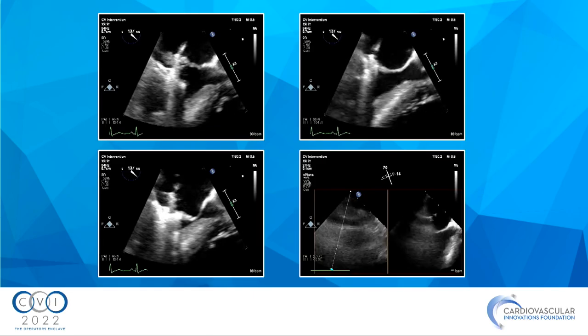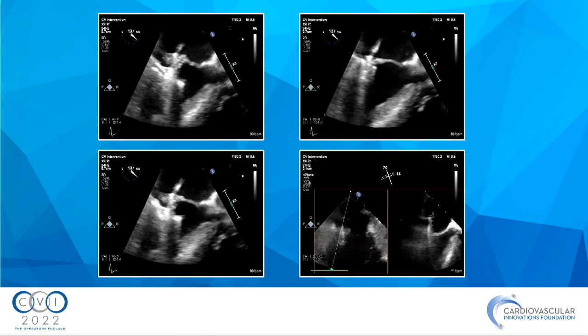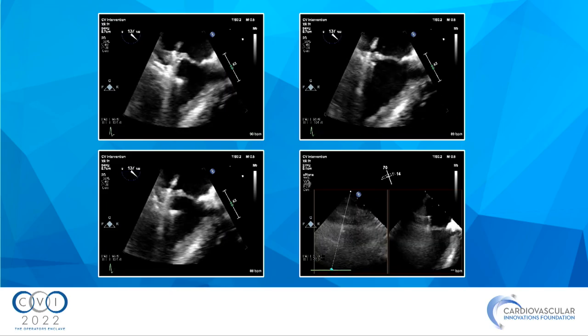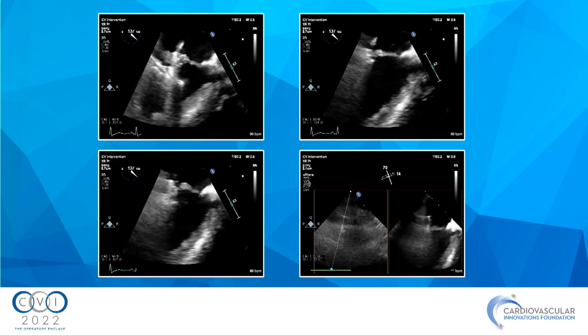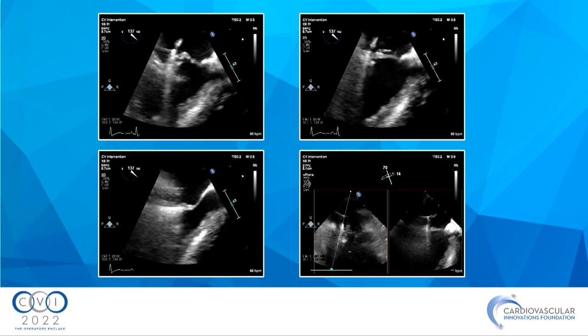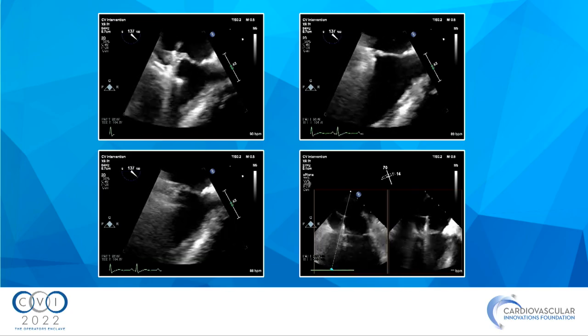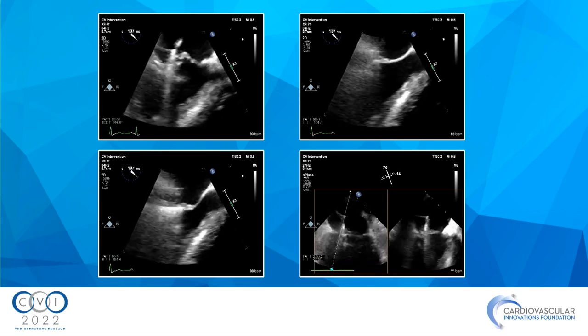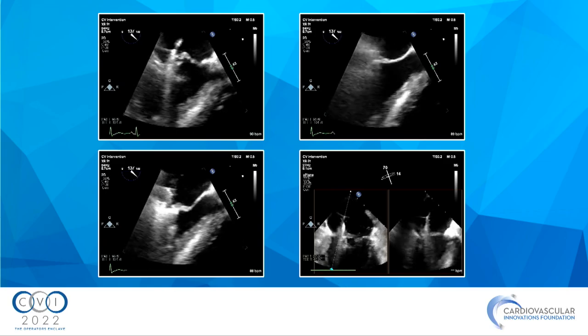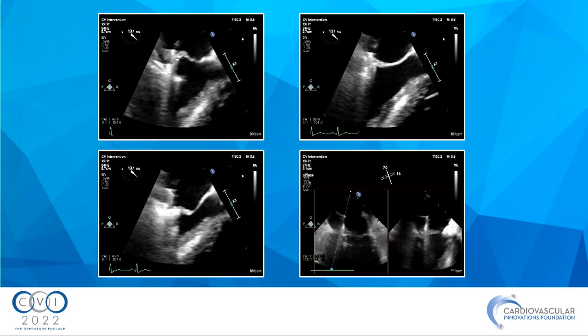So it wasn't great, and so I went back in and just kept working and working and working. I actually thought about adenosine, but I was worried that I would kill him with adenosine, honestly. Many of you probably know, I use adenosine liberally in my clip cases. I really love getting those gaps to come down. But eventually we got it in, and it was actually okay.